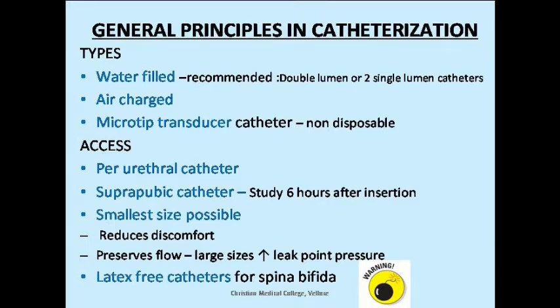What we usually do is that quite a significant number of them sometimes require a lower tract endoscopy. So at the same time we use a cystocath and put in a double lumen, or 2 catheters, and do the study on the same day, preferably about 6 to 7 hours down the line, and they are usually very cooperative with that, but unfortunately it's an invasive procedure.